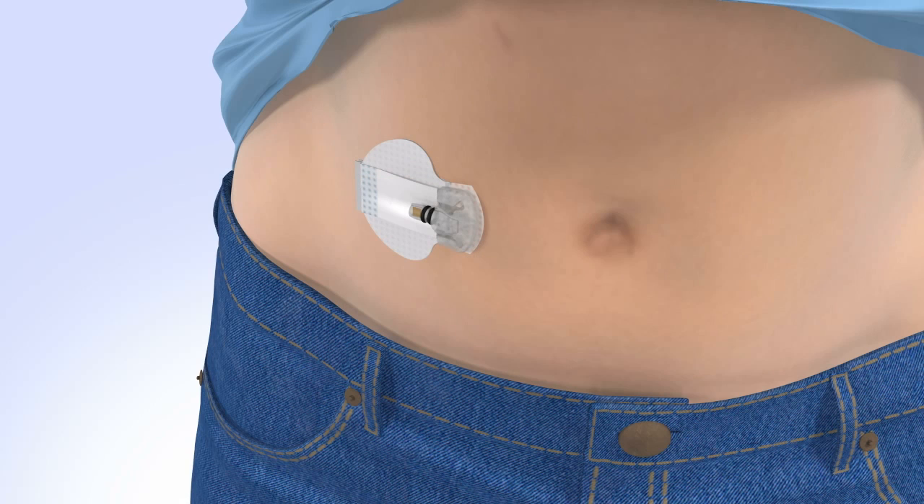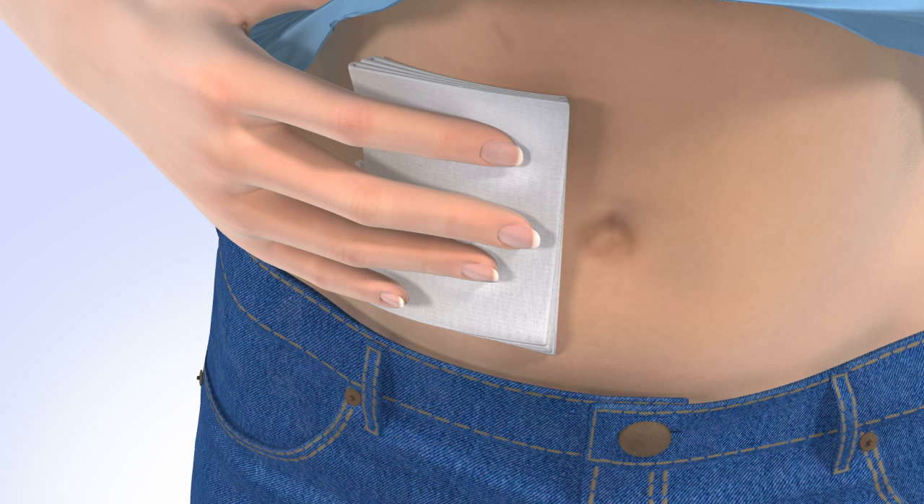Note: if bleeding occurs at your insertion site, place a sterile gauze or a clean cloth on top of the sensor and apply steady pressure for up to three minutes. Please review the user guide for instructions on what to do if bleeding does not stop.